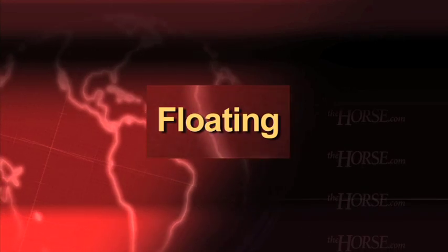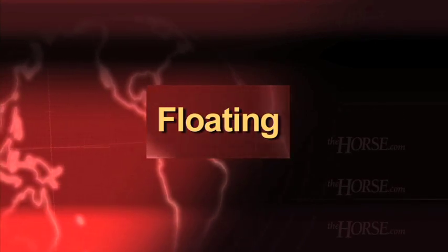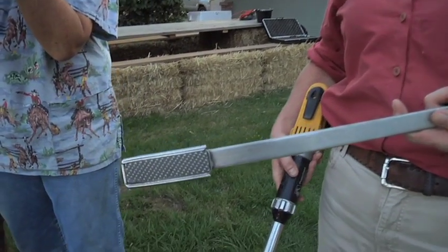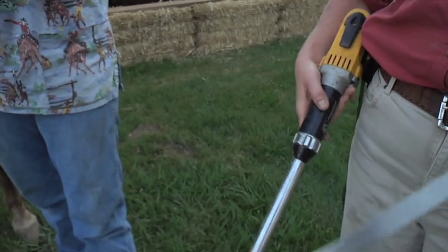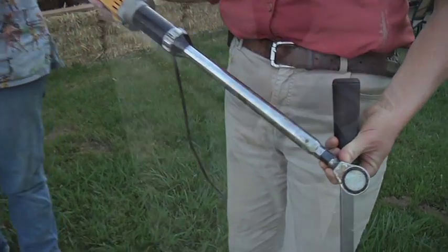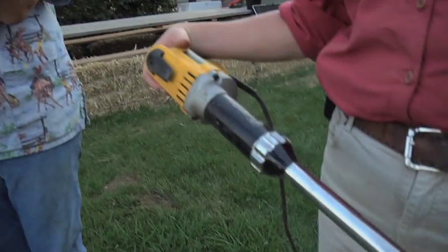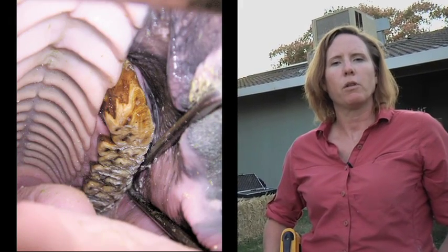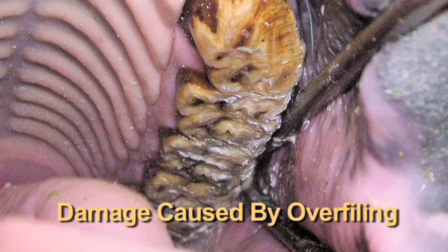When people talk about floating a horse's teeth, what they're referring to is filing down any sharp points, hooks, or high spots in the mouth. You can use either a hand float file such as this, or there are now float attachments that can be mounted on power drills. Whichever method is chosen, it's important to remember not to remove too much tooth and to be careful about maintaining the normal architecture of the mouth.